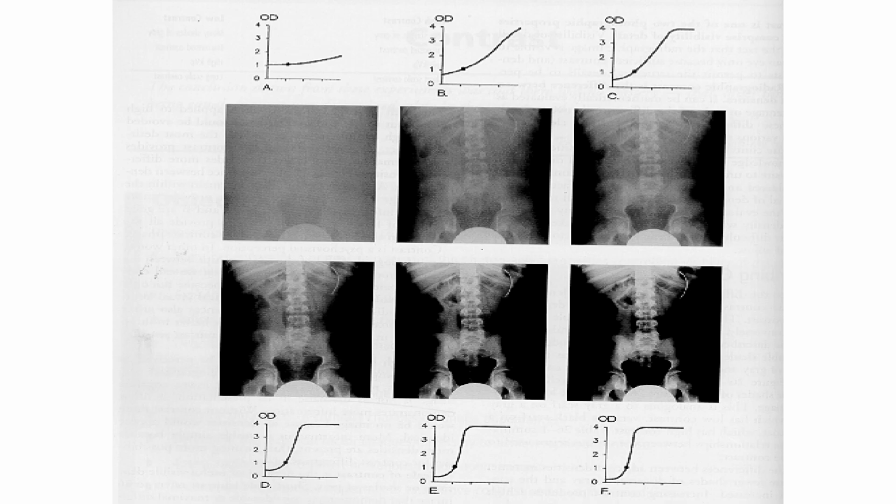Wala po. Wala ba? Meron, pero konti, very minimal. Parang nakikita lang natin ay yung vertebrae, hip bone, and then, of course, the gonadal shield. Then sa letter B, may visible na yung mga structures.